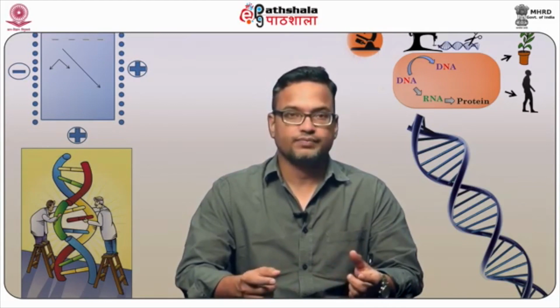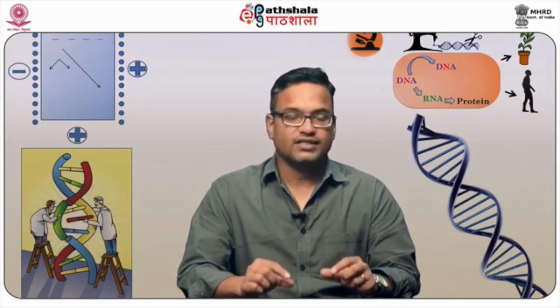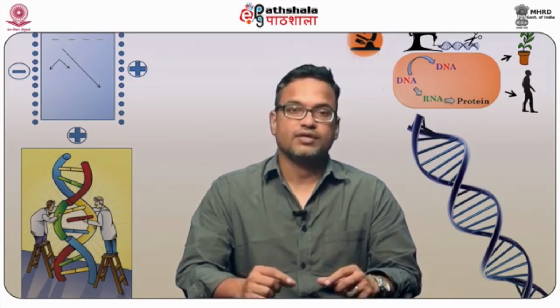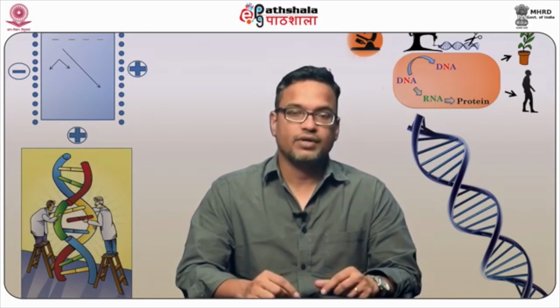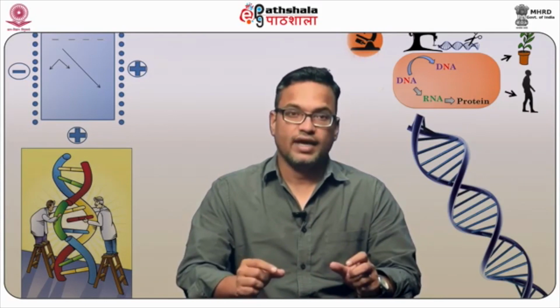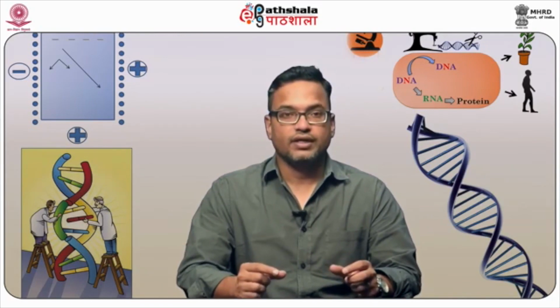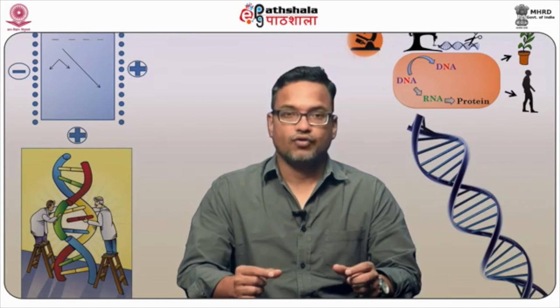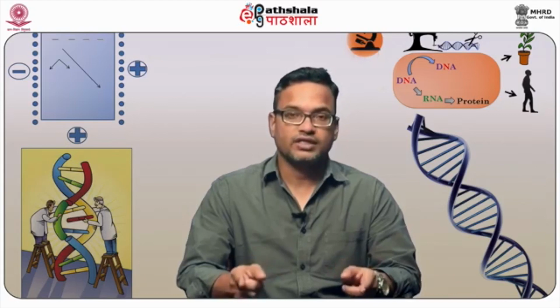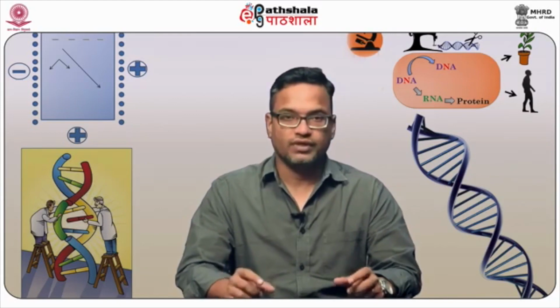However, in indirect labeling, first you take your DNA molecule and attach it to a modified non-fluorescent molecule such as biotin or hapten, and then in the secondary hybridization there will be specific antibodies, through which the fluorophore is attached, that recognize these non-fluorescent molecules. For example, biotin is recognized by fluorophore-labeled avidin antibodies, and that's why this is called indirect labeling, because the probe is not directly labeled with a fluorophore, but there is a secondary label which comes in with a fluorophore.